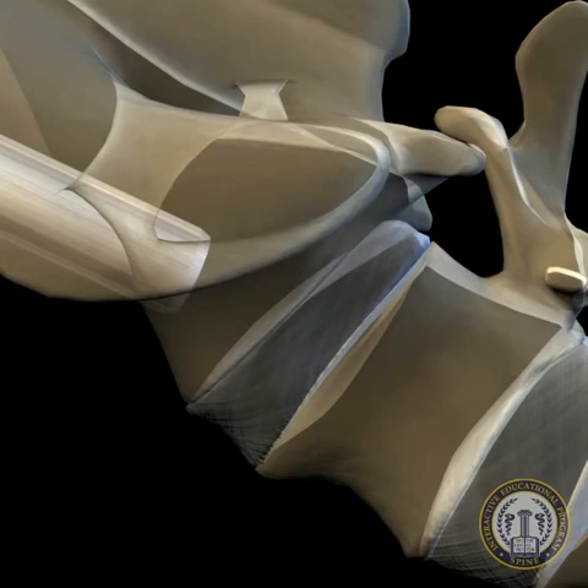Once the working channel is in place, progressive drilling of the sacrum to create a channel and preparation of the disc space may be accomplished. This is done with meticulous nucleotomy and disc space preparation utilizing proprietary nitinol disc cutters. To begin the discectomy, the small radial cutter is inserted up the working channel with the sleeve covering the flexible nitinol blade. Once inside the disc space, positioning is confirmed with biplanar fluoroscopy.